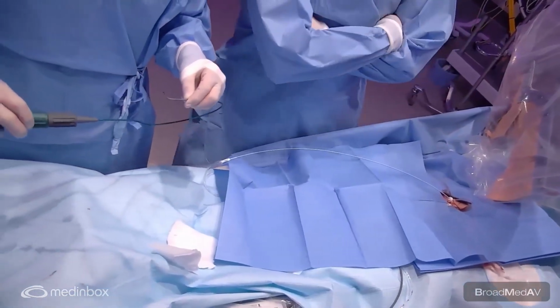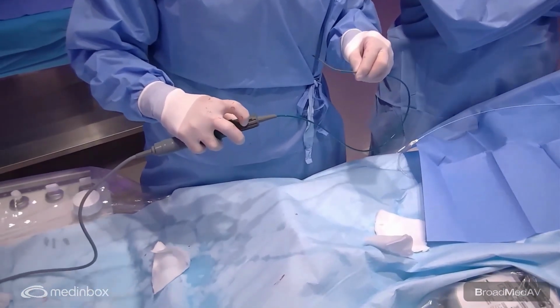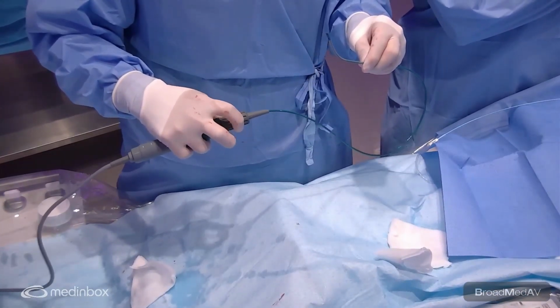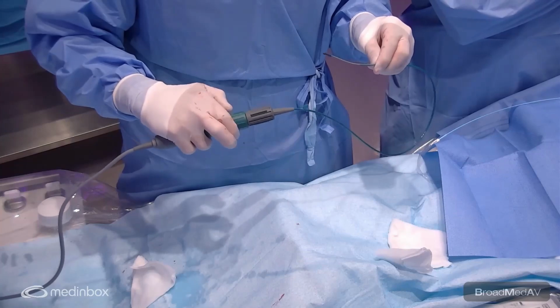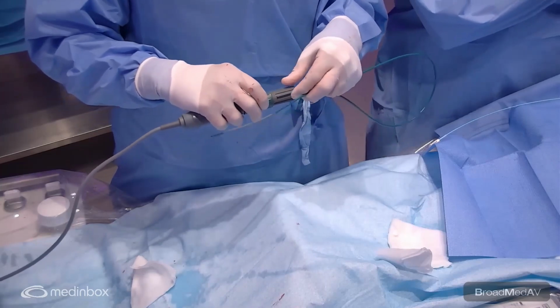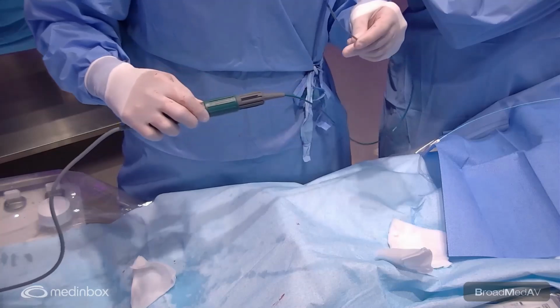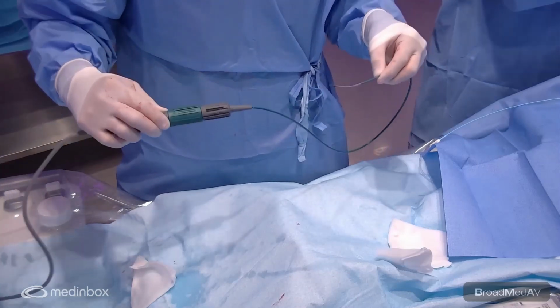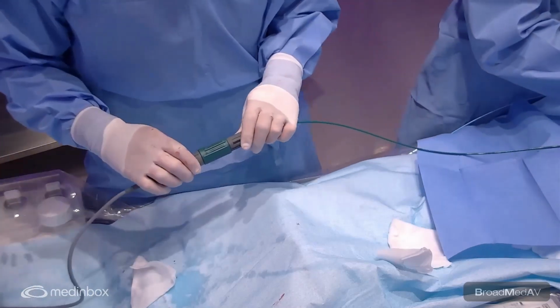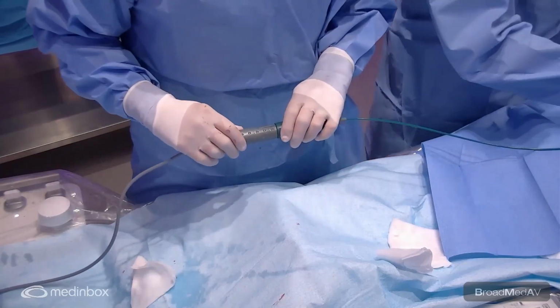Okay, cool. So this is the ICE view from Abbott. See, there's a handle here, and you can turn the tip of this catheter anteriorly, posteriorly, and right, left. So by doing that, you can find your views within the heart. And there's a line here that we can align to be sure that we are in the neutral position. So I'm neutral, we'll introduce that directly in the femoral vein without wire, but we will follow that well.